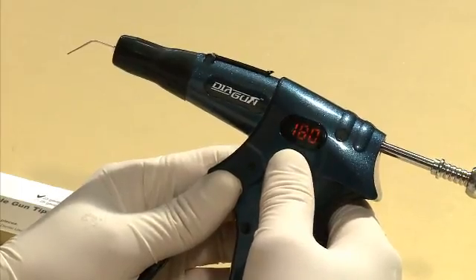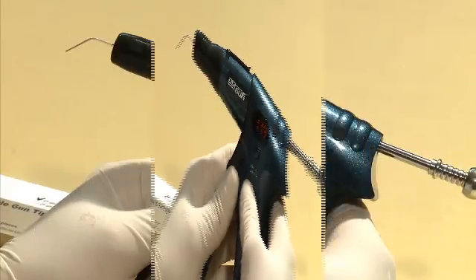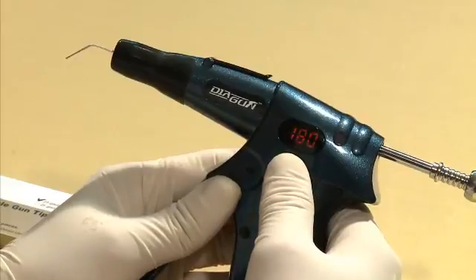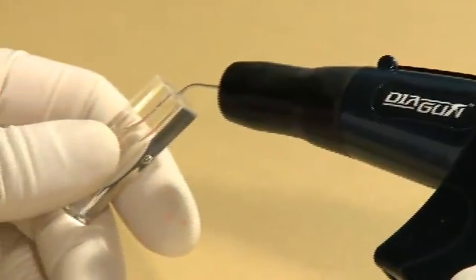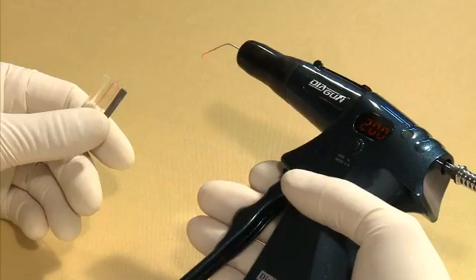Adjusting the preset temperature must be done right after the device is turned on or after the initial selected temperature has been reached. Once the selected temperature is reached, insert the gun tip into the root canal and begin squeezing the trigger to fill the canal with melted Gutta Percha obturator.